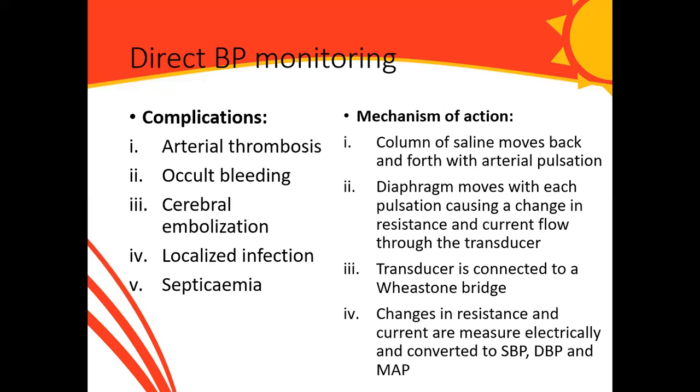We remember that. So the changes in resistance and current are now measured electrically through the transducer, and these are converted to your systolic, diastolic, and mean arterial pressures.